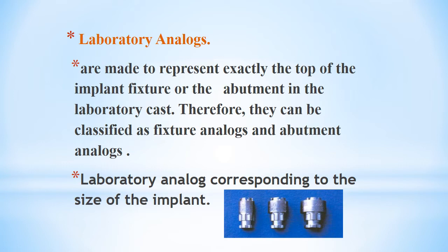The laboratory analogs are made to represent exactly the top of the implant fixture or the abutment in the laboratory cast. Therefore, they can be classified as fixture analogs and abutment analogs. The laboratory analog corresponds to the size of the implant.